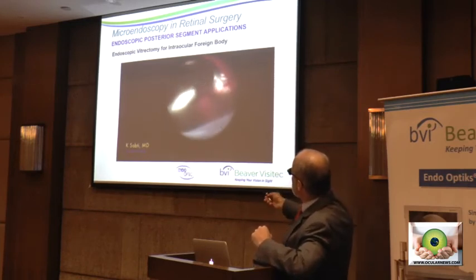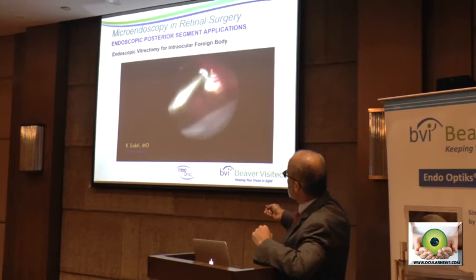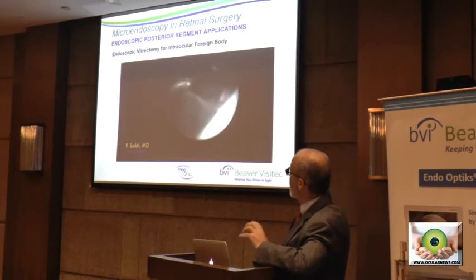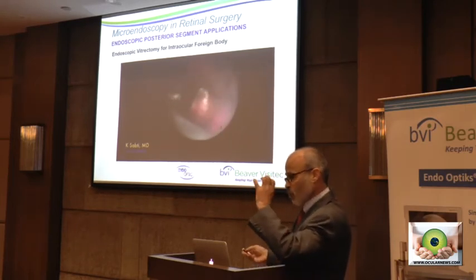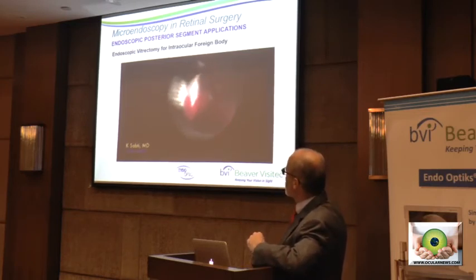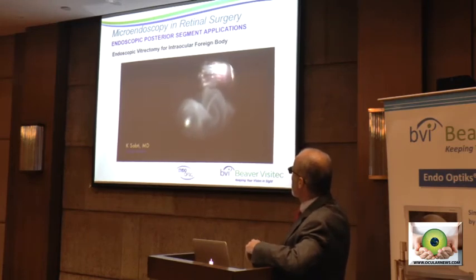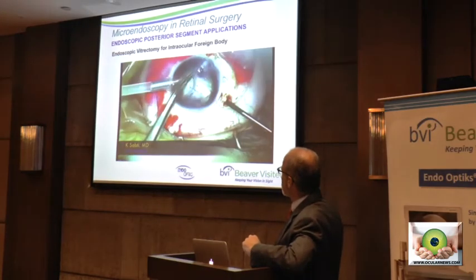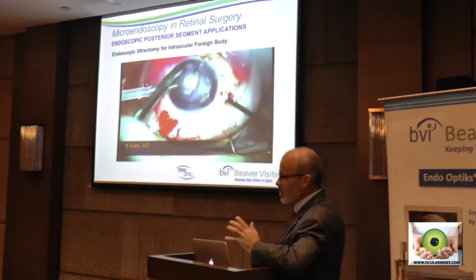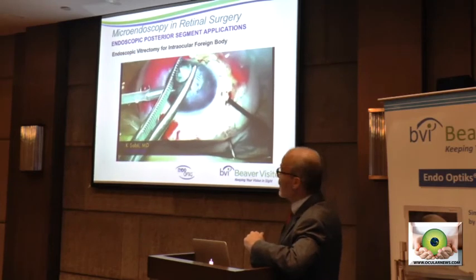So he's able to see this blood clot removed. Some of this was very dense. Just pulling at that intraocular foreign body without having first removed that blood clot, incarcerating it, would have probably created more iatrogenic damage. But here he's able to remove it rather handily. You can see the retina completely detached here. He's going to pull this through the cornea in a moment, and then he'll go back in under endoscopic view, reattach the retina. And this child actually did quite well.